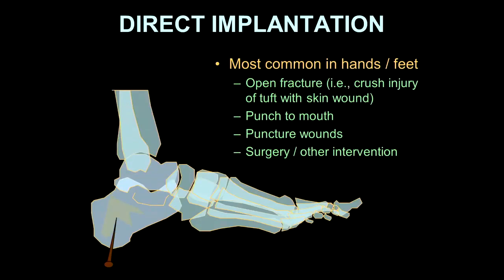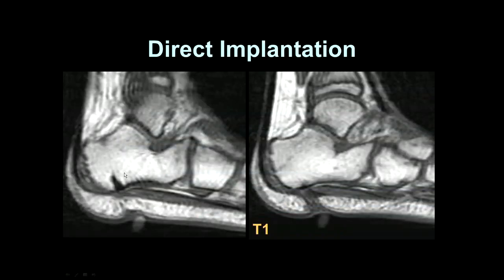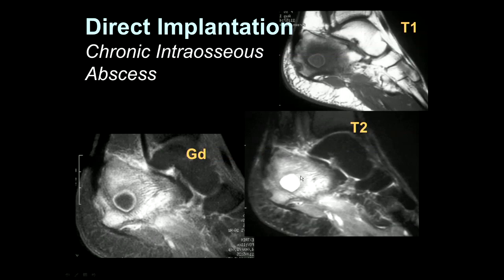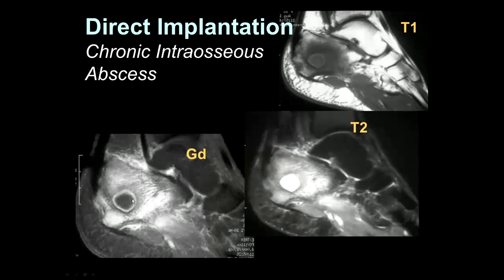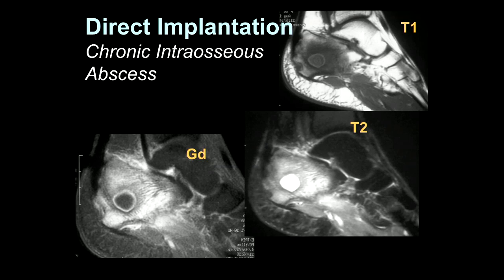Direct implantation can also occur, especially in the hands and feet — open fractures in the fingers, a punch to the mouth with inoculation of the tendon sheaths, puncture wounds of the lower extremity, and also after surgery or other interventions. Here's an example of direct implantation: a young patient stepped on a nail, and here is the tract of the nail extending into the calcaneus. Here's a patient who developed an abscess after stepping on a nail many years ago. These infections can get walled off and become chronic and indolent, reoccurring periodically as the body's defenses are challenged.